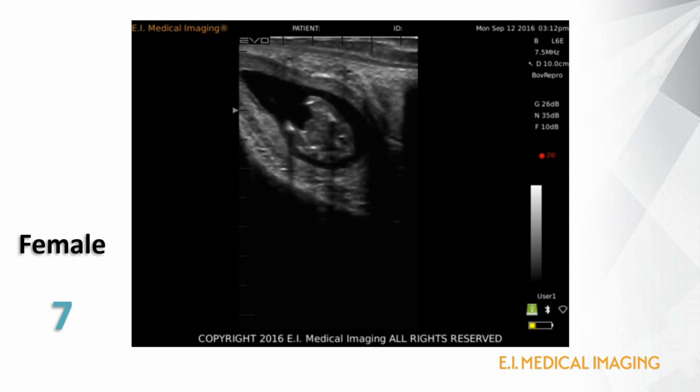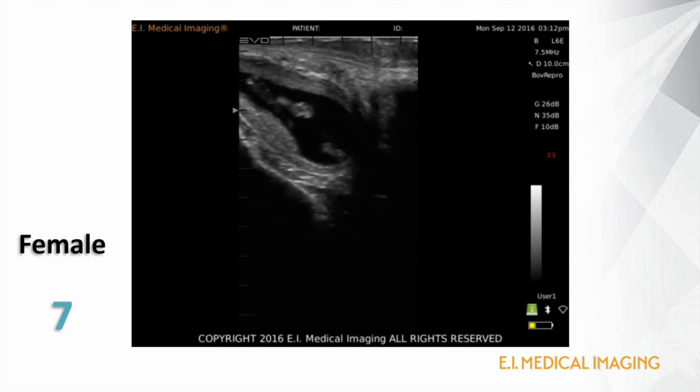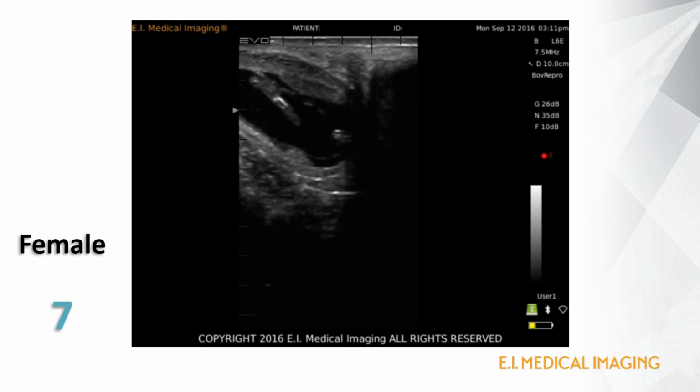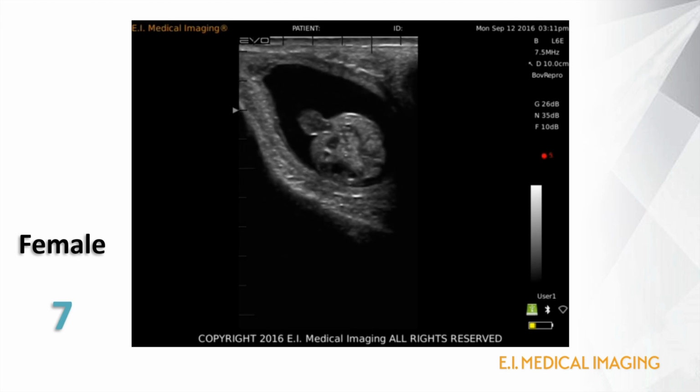When we return to the tail end, the female GT is visible, although less convincing in this view. Confidence is gained by that absence of a male GT. This is a heifer calf.